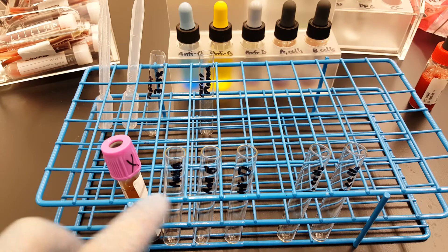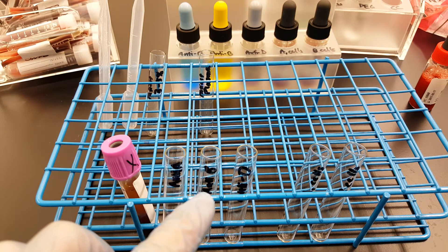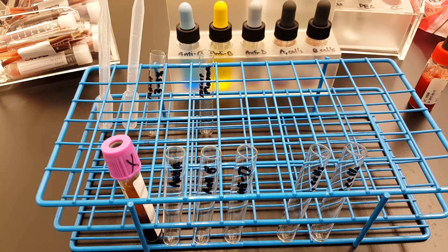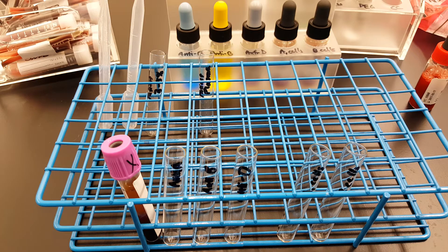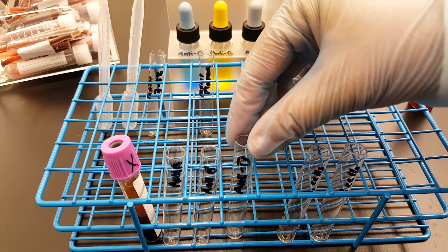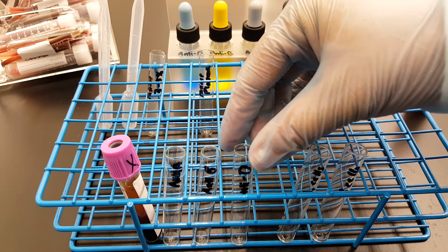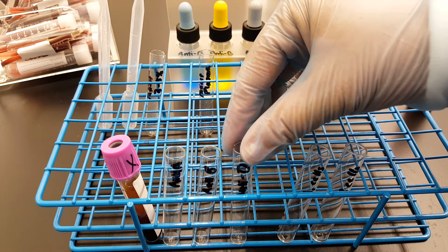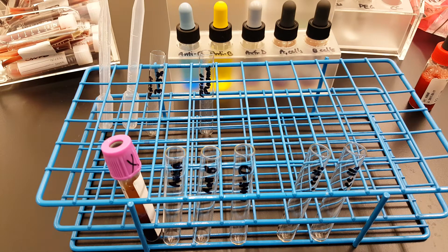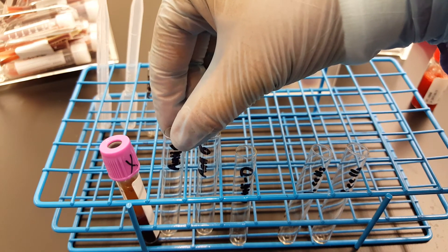So we think A, B positive — that would be a positive in this tube, a positive in this tube, and a positive in that tube. If we were thinking O positive, we would have a positive in the anti-D, because D is what everyone considers RH, even though RH is actually a group. The D antigen is what we're looking at when we think of something AB positive or AB negative. If we had O, then we wouldn't have either one of these two antigens on there, so these two reactions would be negative.